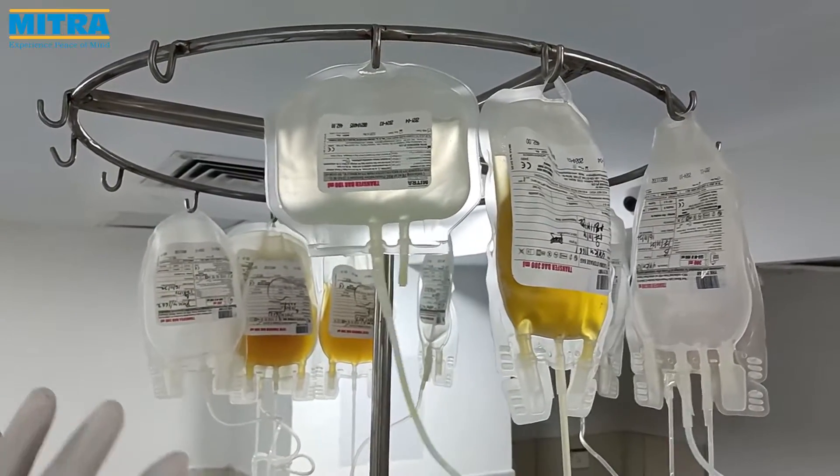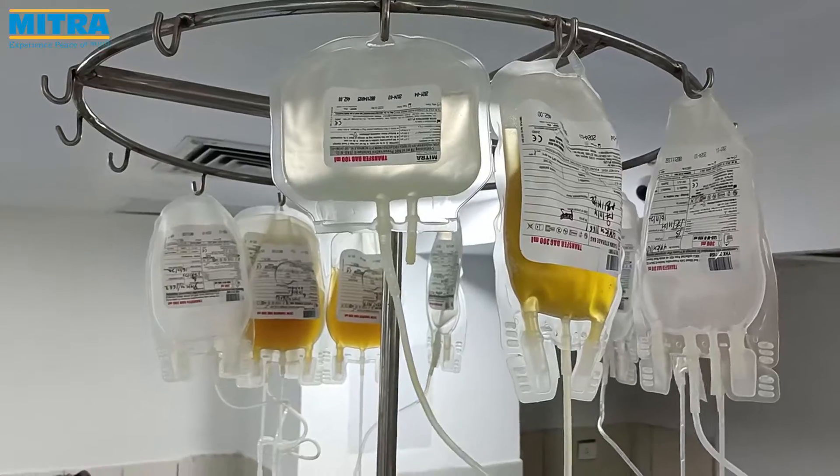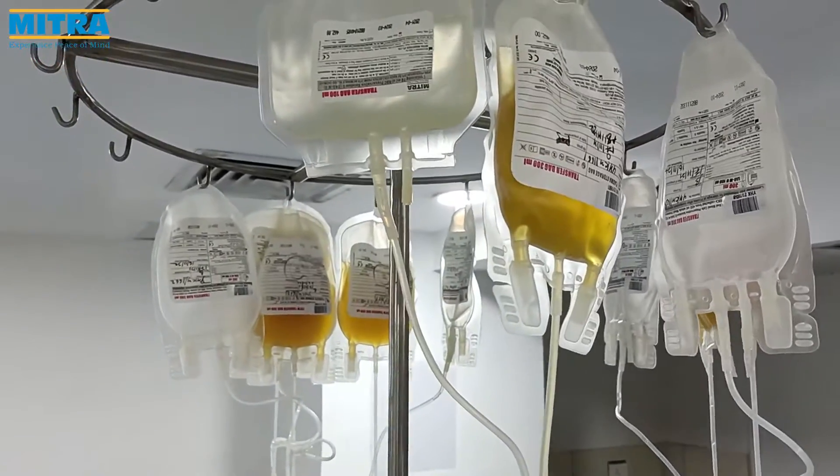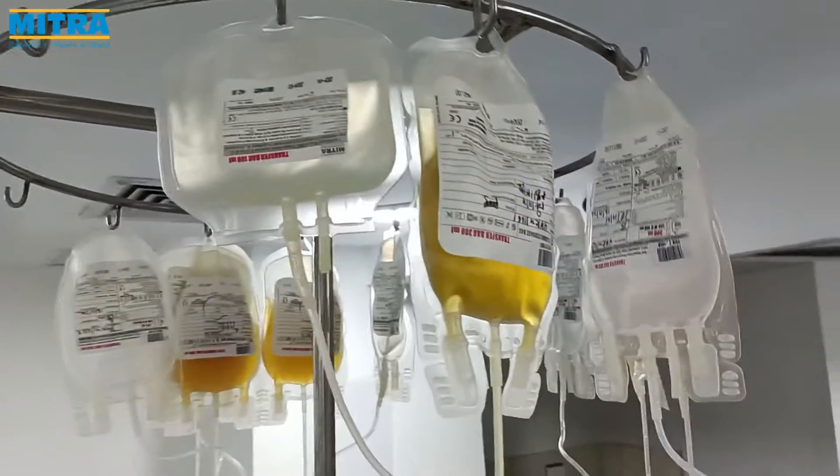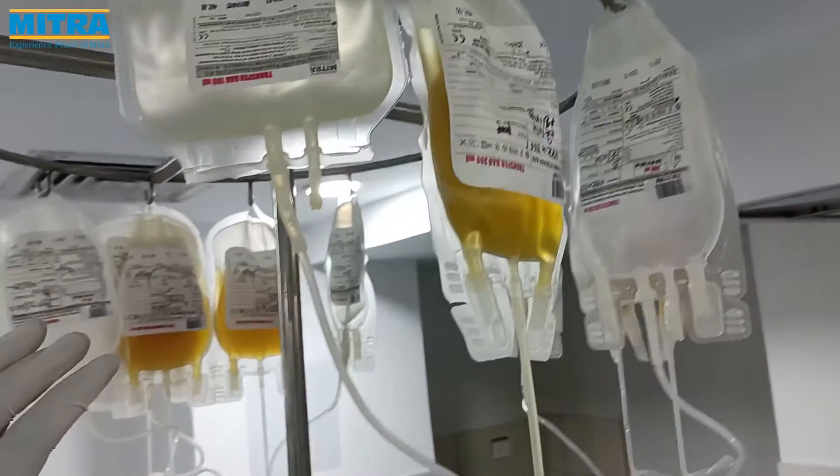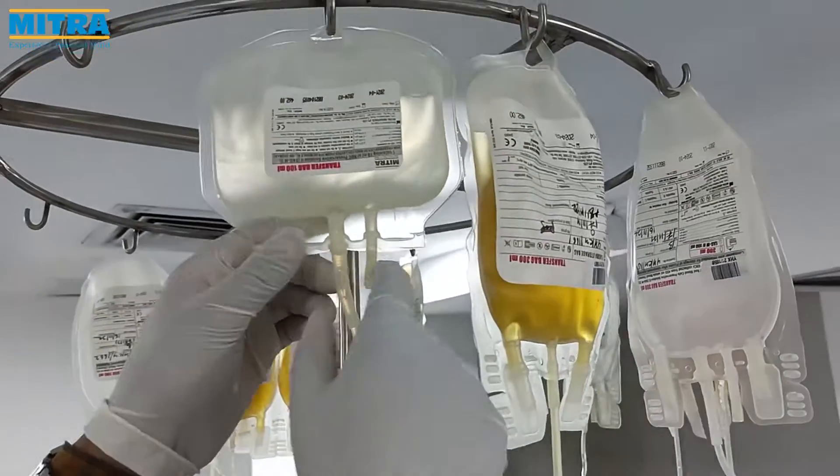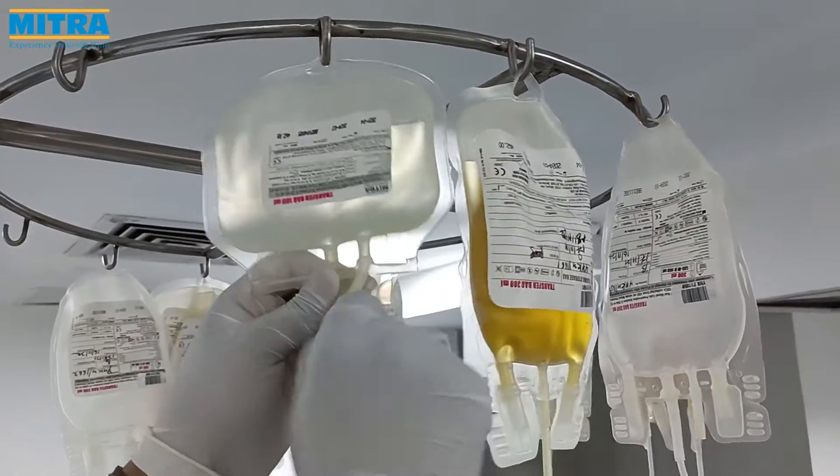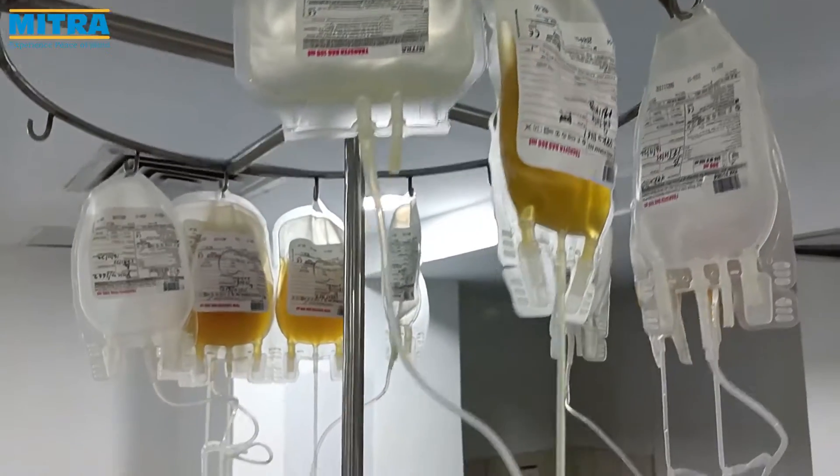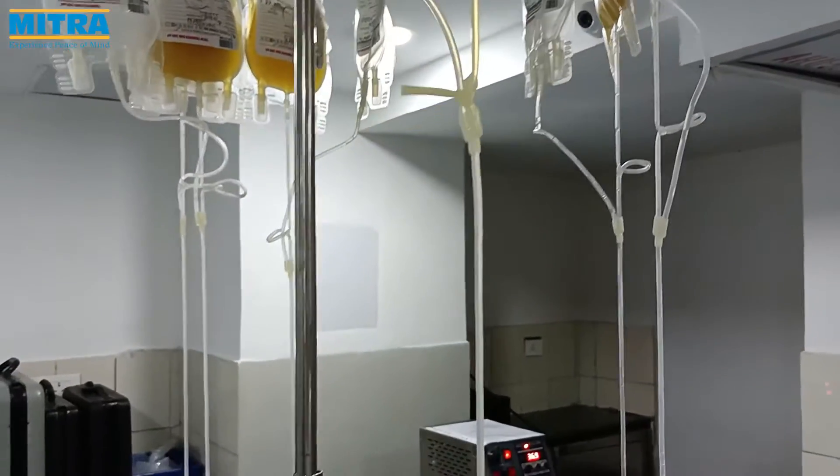Hang the sagam bag and plasma bags on an IV stand. Knot or clamp the plasma bag. Now break the breakaway valve of the sagam bag to allow the sagam to flow freely due to gravity force into the PRBC bag.